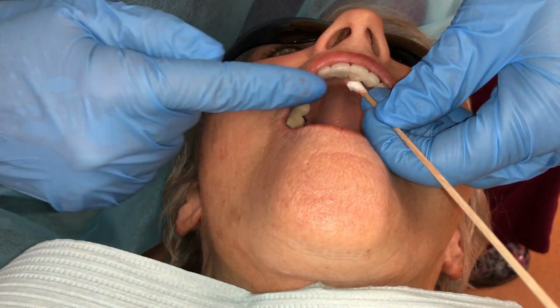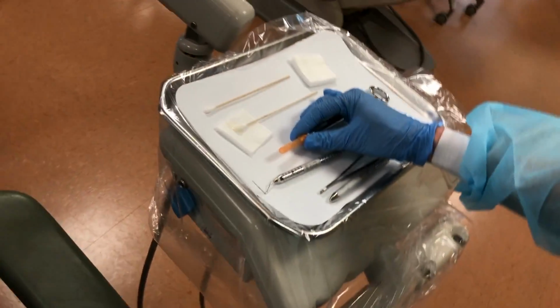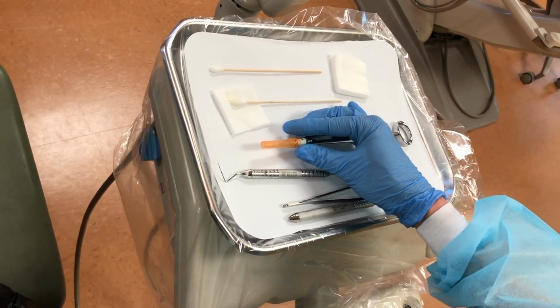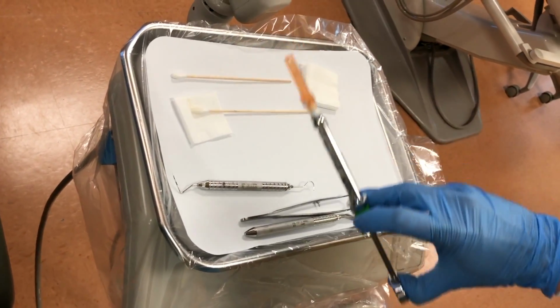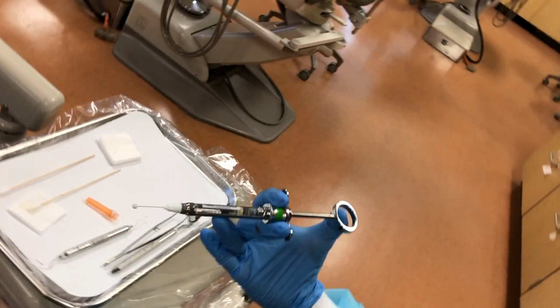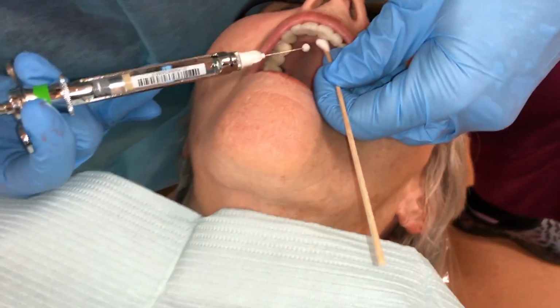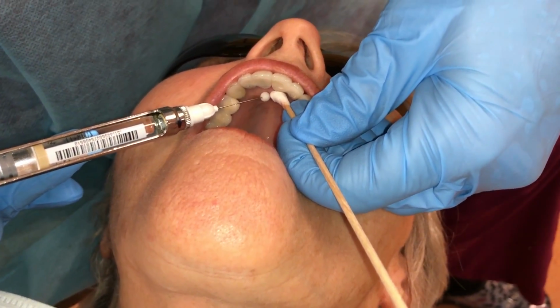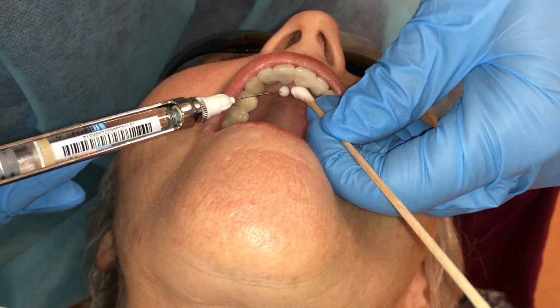The clinician will first dry the area and apply topical anesthetic for 1 minute. Then, if using a cotton tip applicator, apply pressure for 1 minute. Continue applying pressure until initial needle penetration and initial blanching has been observed. It is critical the clinician does not touch the tip of the needle to the cotton tip applicator.